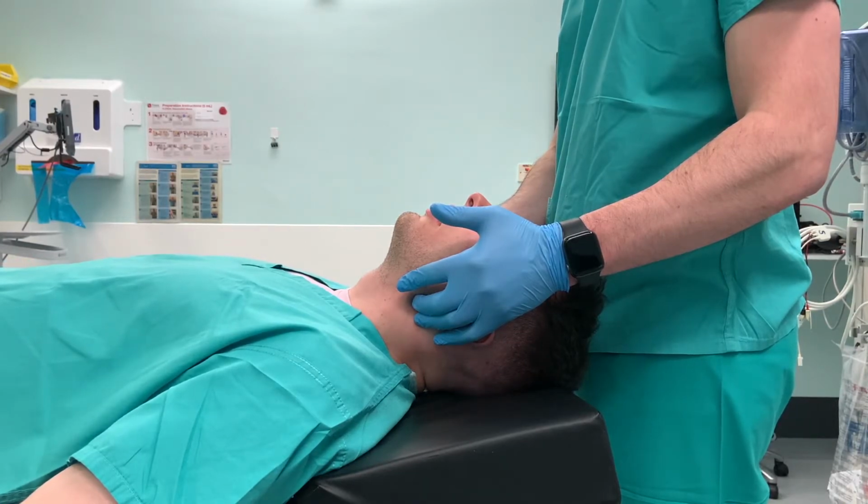Once you've successfully opened the airway, you now need to assess to make sure you can still get good oxygenation. Use a simple face mask or trauma mask, or you can bag valve mask them, either with a 2-person or a 1-person technique to ensure good air entry into the lungs.